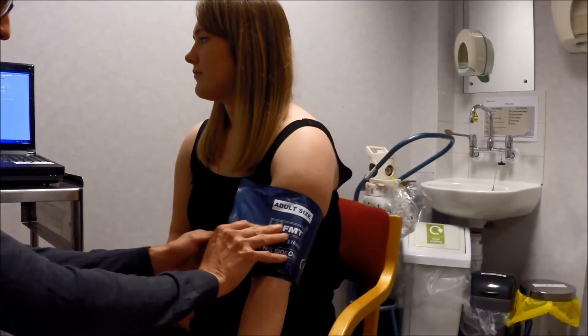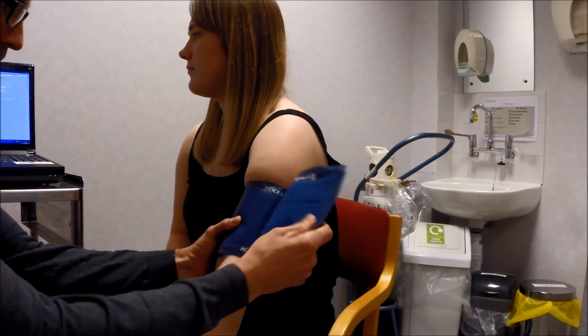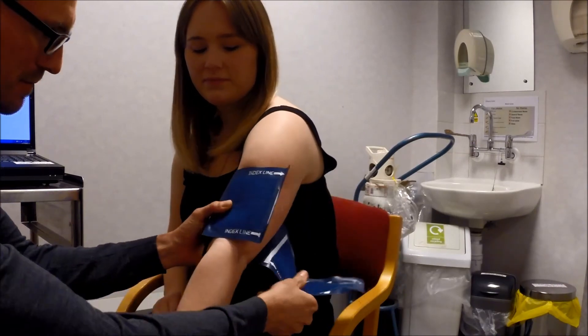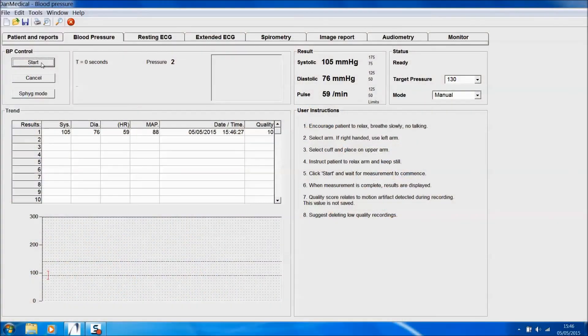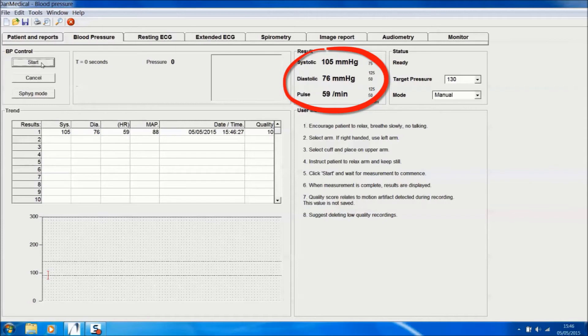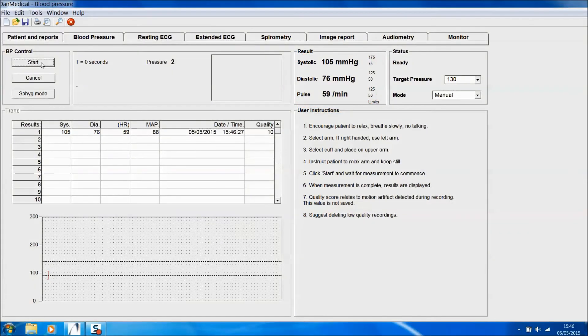Once the test has completed, you can remove the cuff from the patient's arm. The results of the test are shown on screen. Here we've got a result of 105 over 76.